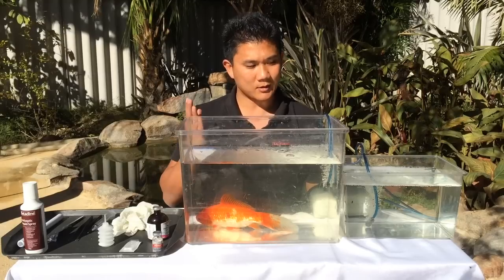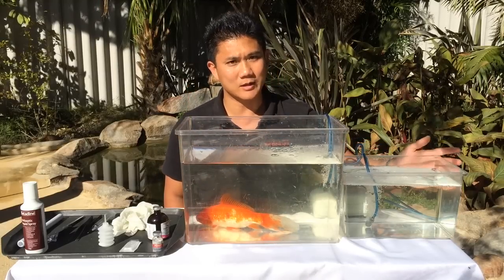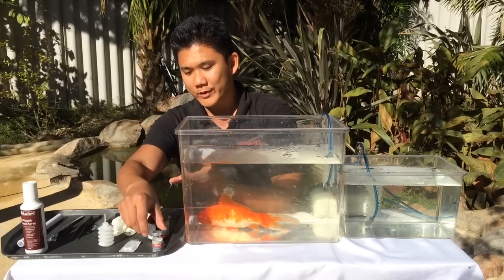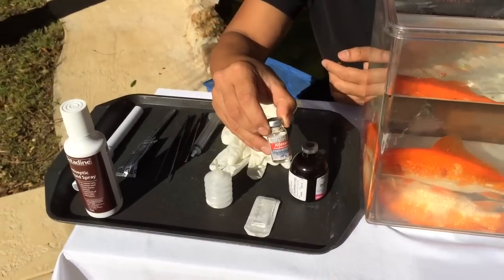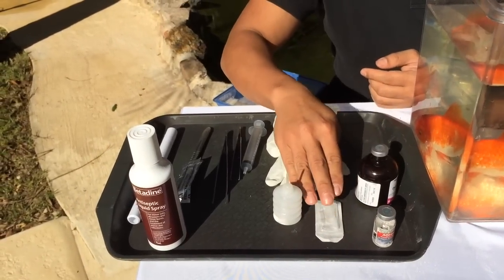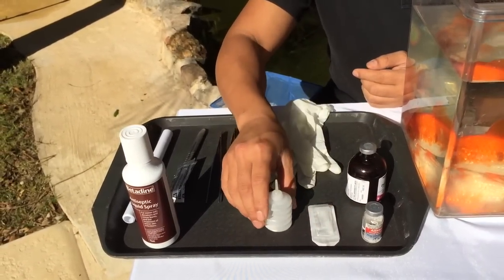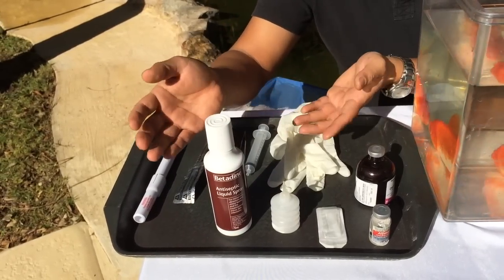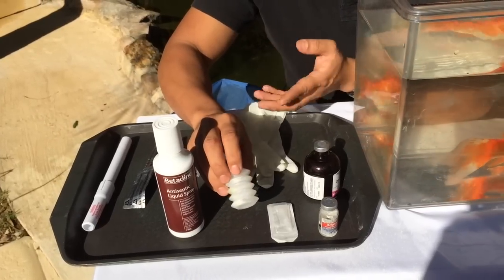So how we're going to do this is we're going to anesthetize him. We've got an anesthetic bath already prepared, and here we've got all the different equipment. The anesthetic is Alfaxalone, which is available in pretty much every small animal clinic. Other things we'll be using to control hemorrhage is epinephrine. As a topical antiseptic we're going to use a combination of betadine, and as you know when you put betadine on fish and replace them with water it washes off.